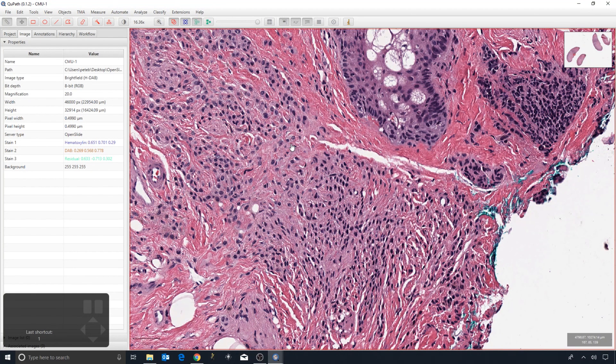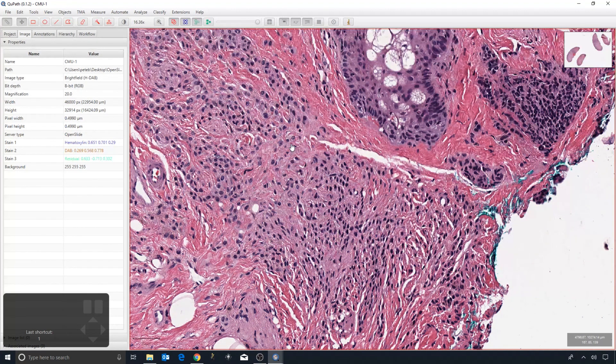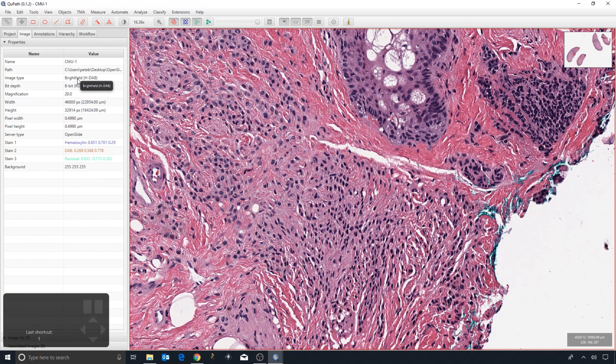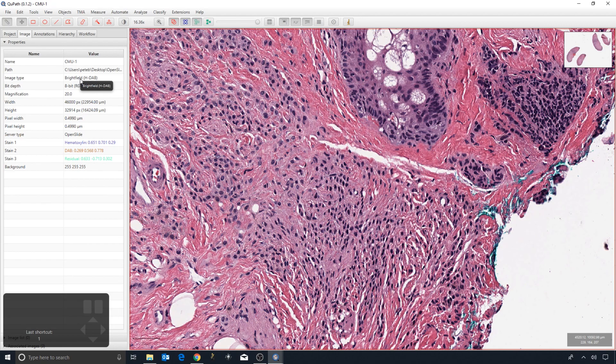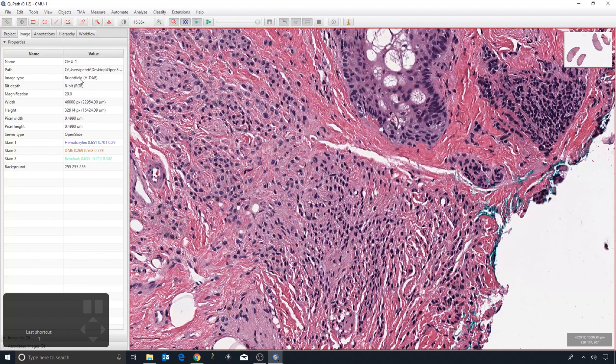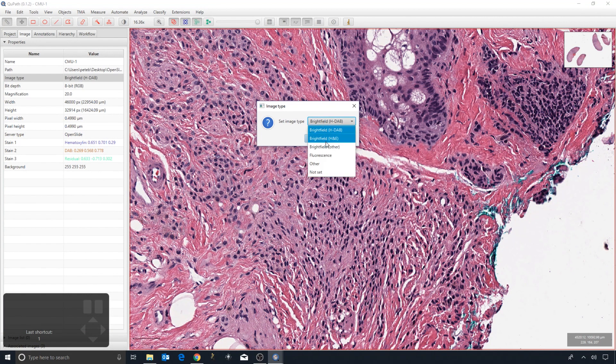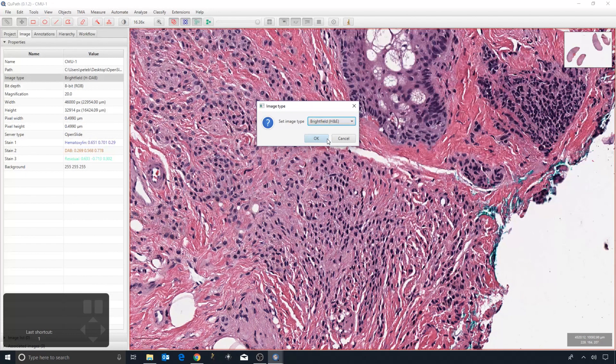...to be sure, if you're going to process an image in any way, that the image type is correct. Be aware that QPath is making its best guess. If it's wrong, you should always check it, and if it's wrong, you can double-click and then you can set the image type to be something more appropriate.